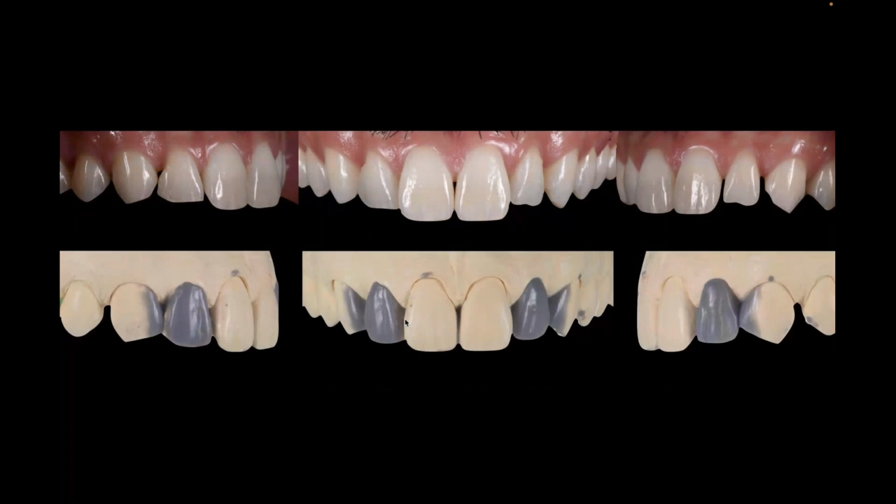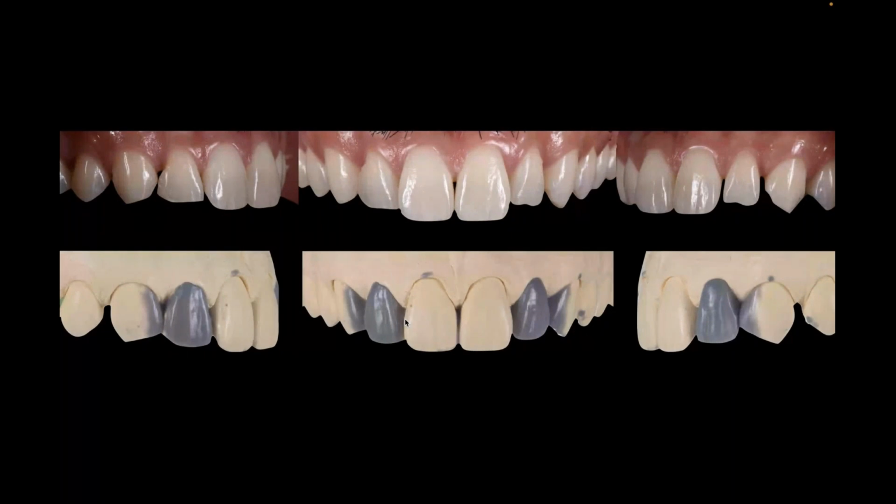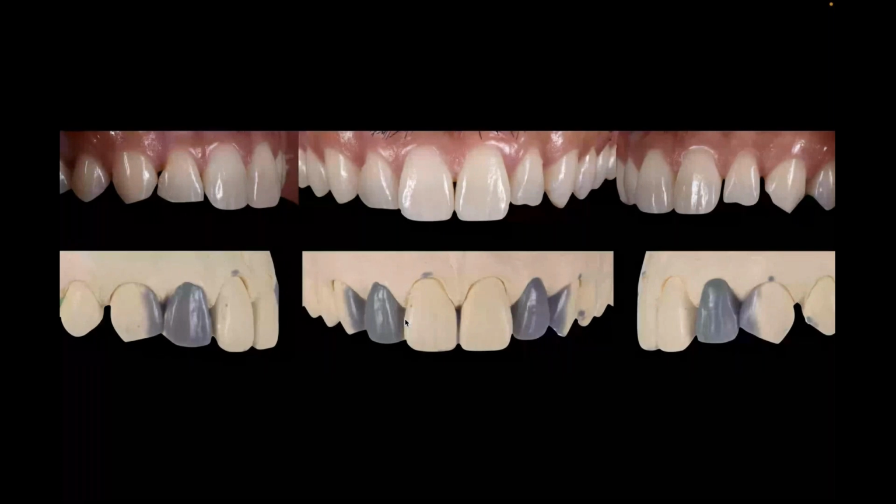So because of the space that I had to fill, it wasn't a tremendous amount of space, meaning that I didn't have a short prep that had to lengthen 4 or 5 millimeters of ceramic. I was very comfortable using a feldspathic material, but I was even more comfortable using a feldspathic milled material.